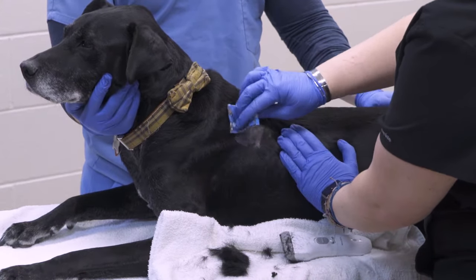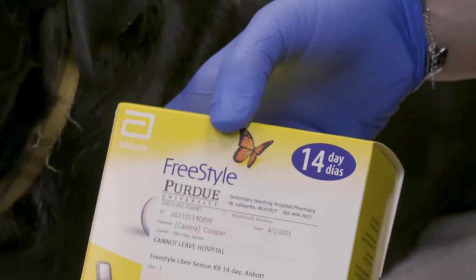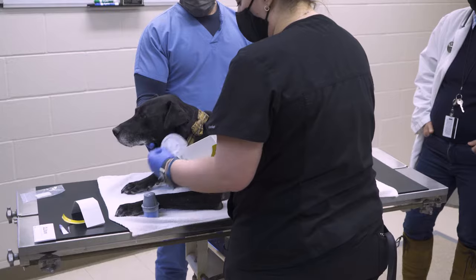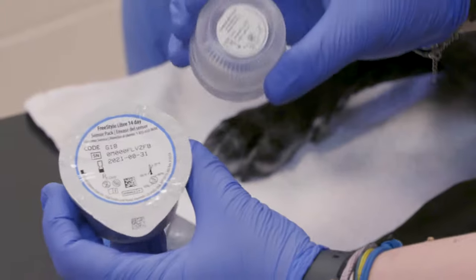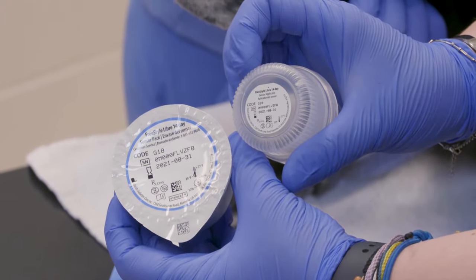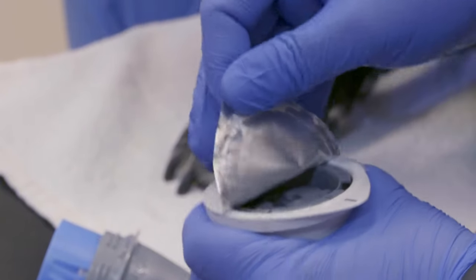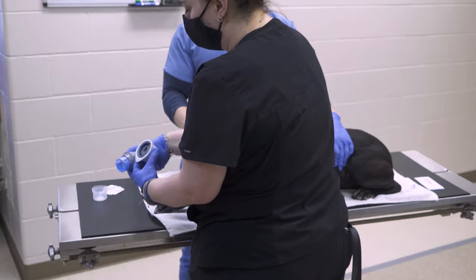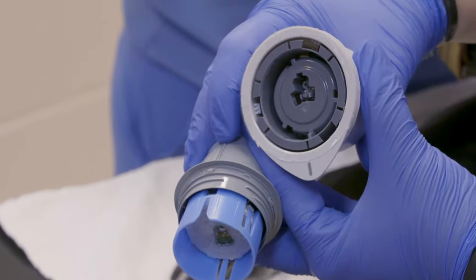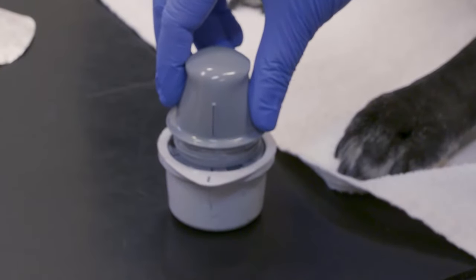Once you have prepared the skin, you are ready to prepare the sensor for placement. The sensor comes in two parts, the sensor applicator and the sensor pack. First, check that the product codes of the sensor and applicator are identical. Then, peel the lid completely off the sensor pack and unscrew the cap from the sensor applicator. Place the sensor applicator into the open sensor pack and line up the dark mark on the applicator with the mark on the sensor, as shown in the video.